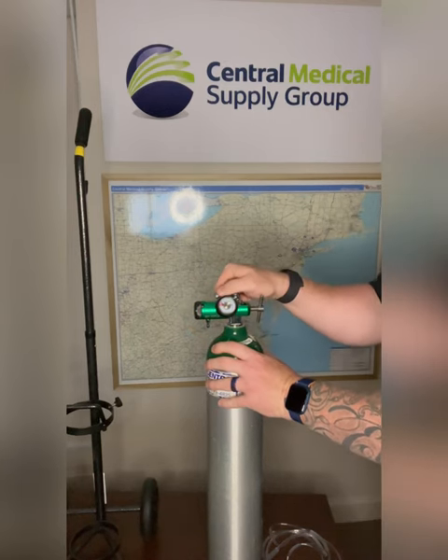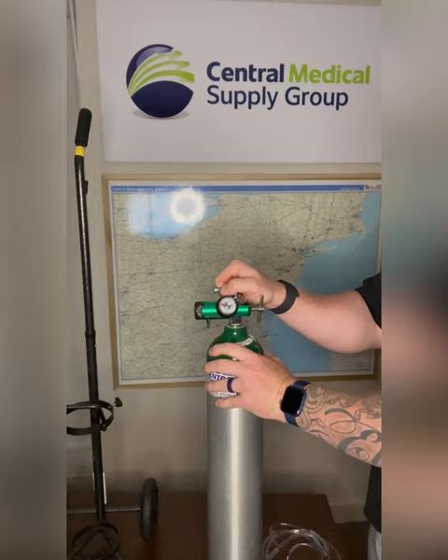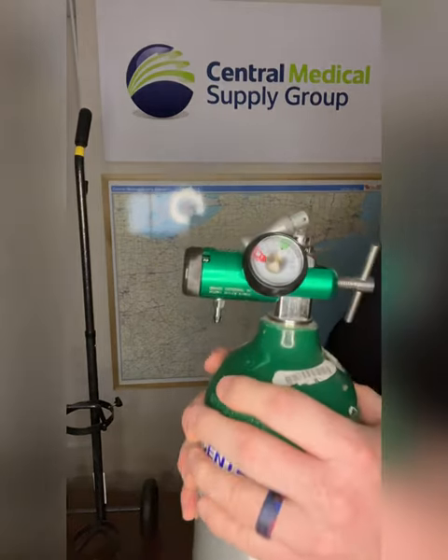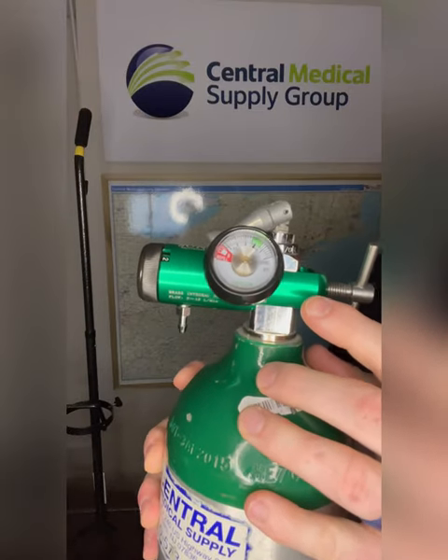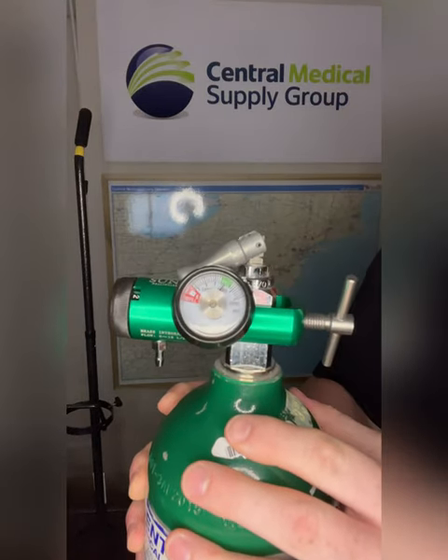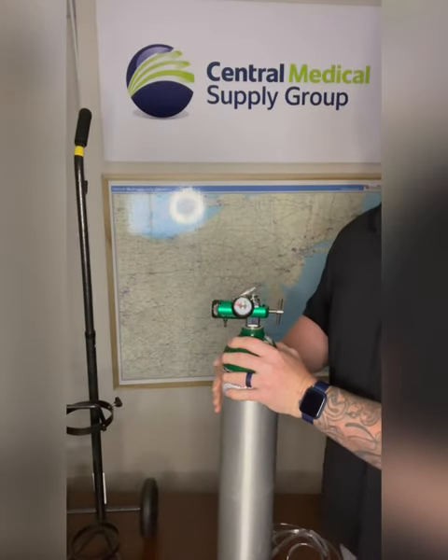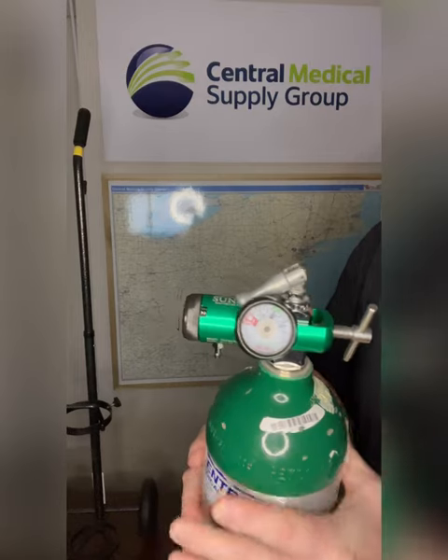Then you want to open the oxygen tank valve by giving a half turn to the left. Verify that the regulator's pressure gauge shows the correct pressure level for the oxygen tank. You can then adjust the flow rate for the individual using the backup tank.